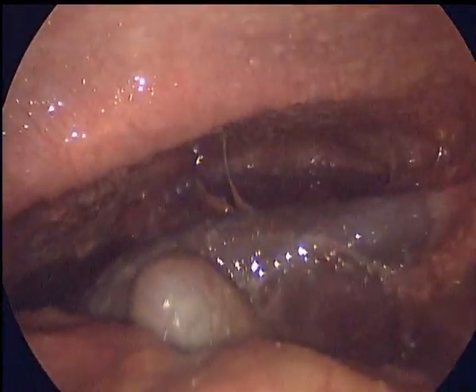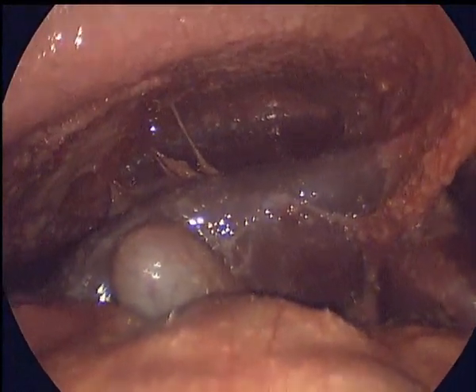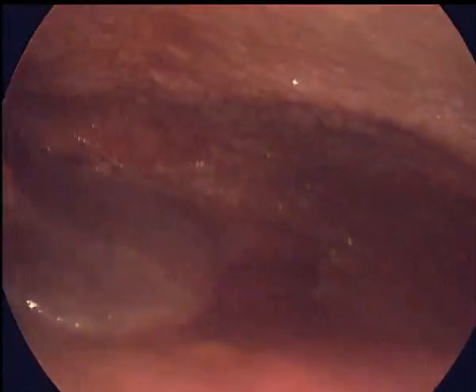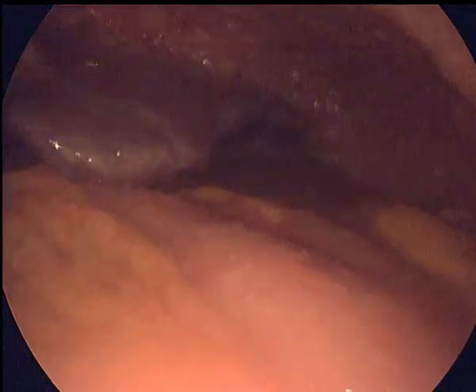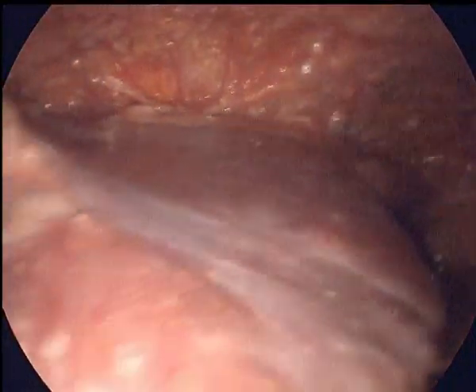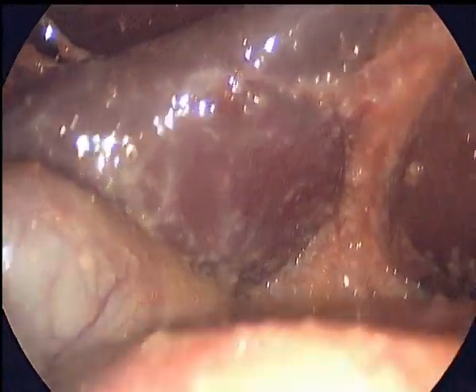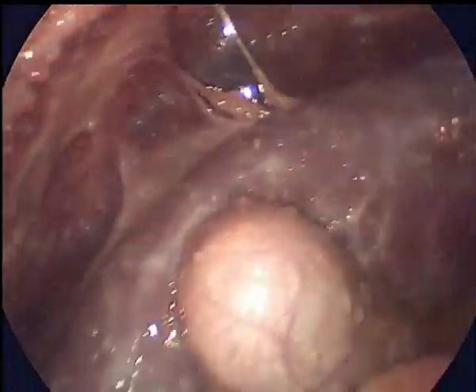Here we can find our right diaphragm, our liver surface, our gallbladder. This is the falciform. All are involved with the peritoneal deposit. Here we can find also the left diaphragm involved. This is the porta hepatis. Here you can clearly identify the porta is studded with multiple deposits.